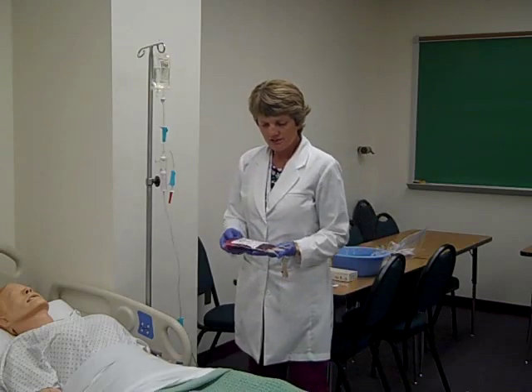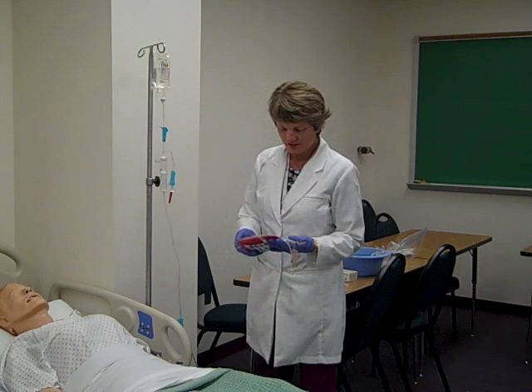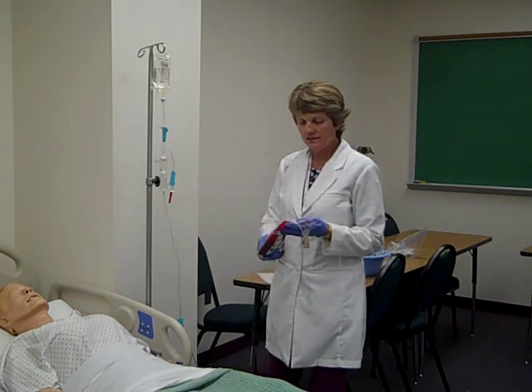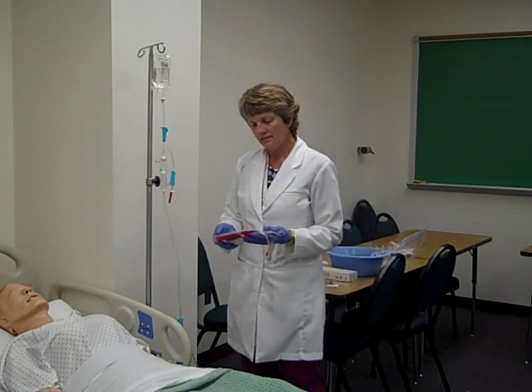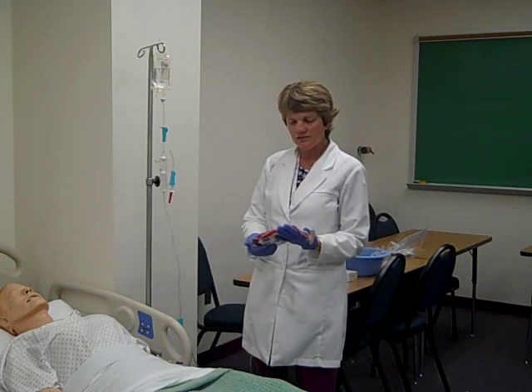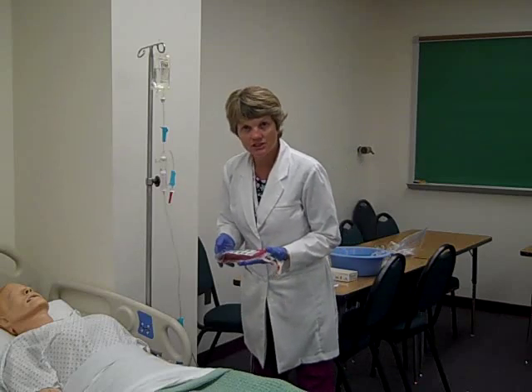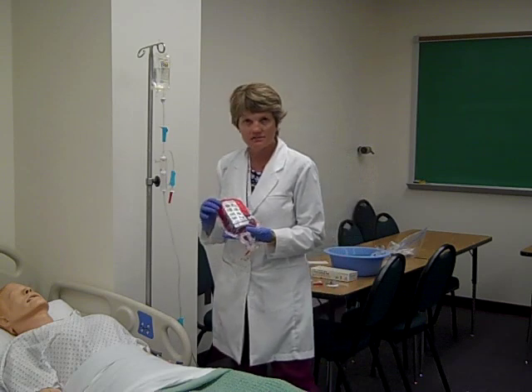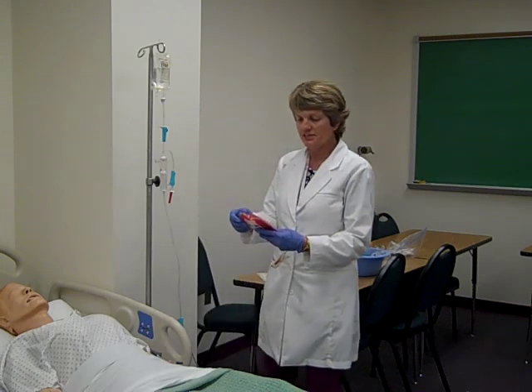Now I'm going to go ahead and just gently rotate the blood bag, mix up the preservative, mix up the cells a little bit. I don't want to shake it, just gently rotate it. But it's also at this time that I can actually assess the blood, make sure it's not brown, bubbly, leaking, anything that might indicate that there's bacteria in there.